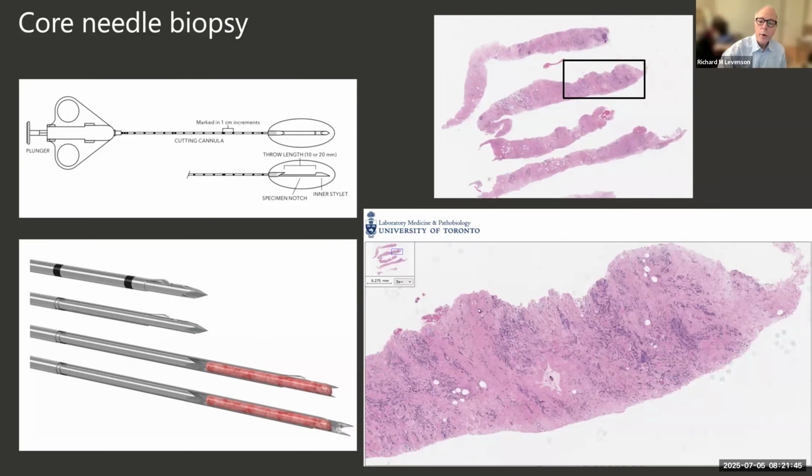And what you see on the top right is 4 of these needles that are sitting on a glass slide, having been processed. And you can zoom in and even zoom in further if you wanted to. And you can see that this is not normal breast. It's in fact lobular carcinoma of the breast. And so a diagnosis, and really a quite well configured diagnosis, can be arrived at just from these core needles. And in fact, the story, of course, doesn't stop there.